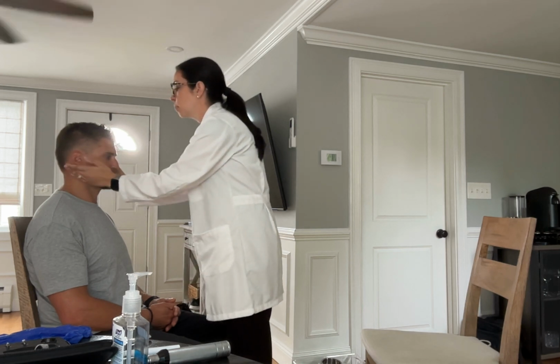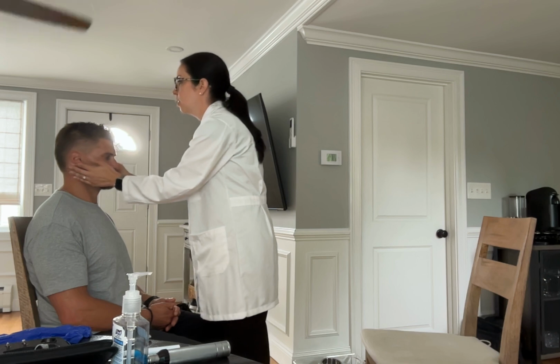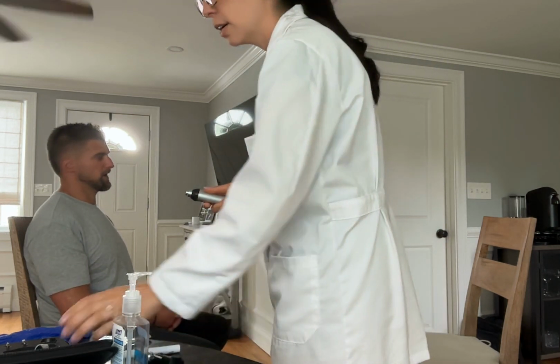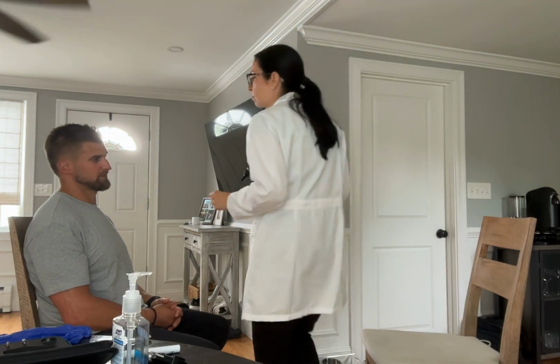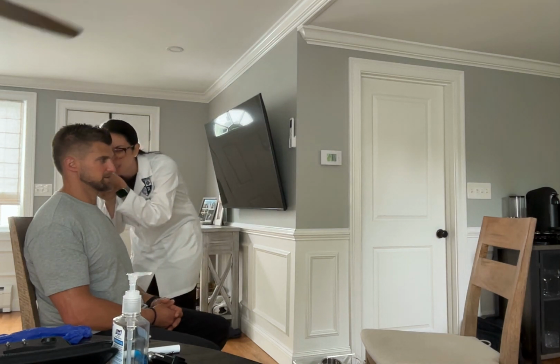And then the mastoid process, the bone behind the ear. Any tenderness or pain? No? Okay. Next, I'm going to get my otoscope and do an exam internal into his ears. Okay, I'm going to turn this on. And I'm going to be looking for canal patency, cerumen, and his tympanic membrane.